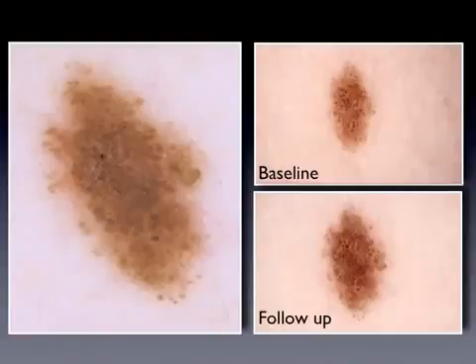In this example, we see a globular nevus consisting of uniform and densely aggregated globules. And if we look at the baseline image, we can see that this globular nevus is small. During follow-up, it enlarged, but it maintained its globular pattern.